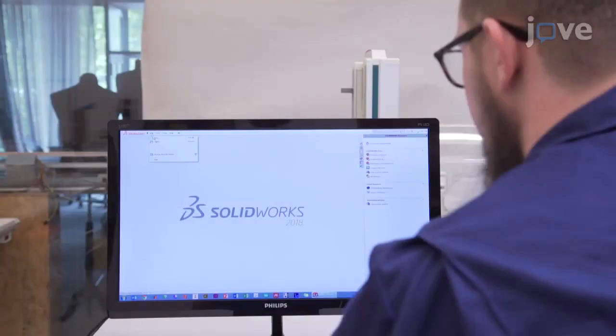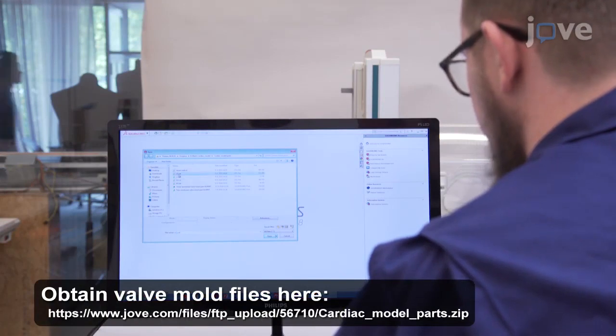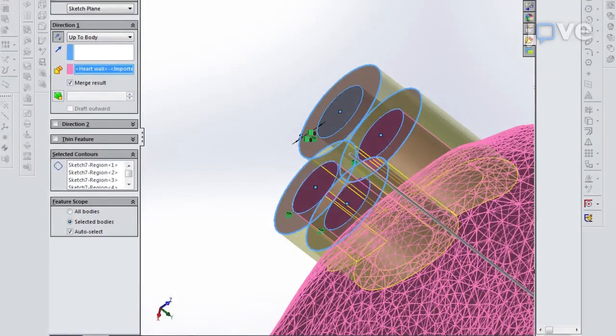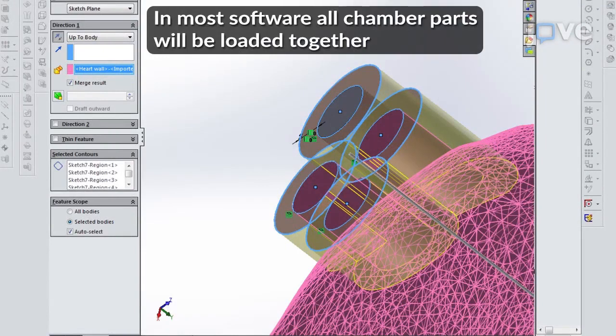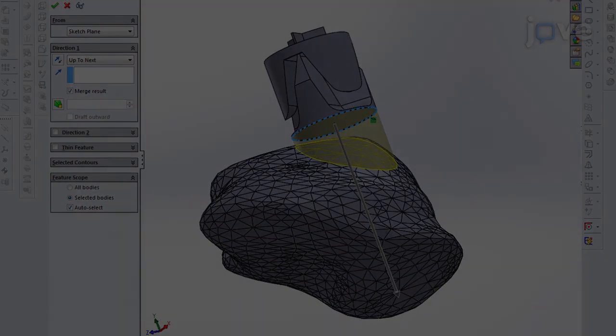For processing and printing of the neonatal heart mold pieces, load the atria and ventricle valve mold files into a computer-aided design software program, and use the original MRI to determine the positions of the aortic, pulmonary, mitral, and tricuspid valves. Using the Insert Part function, drag the valve files for the positive and negative mold halves.